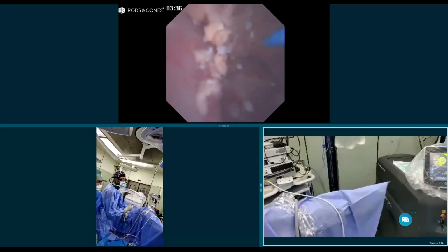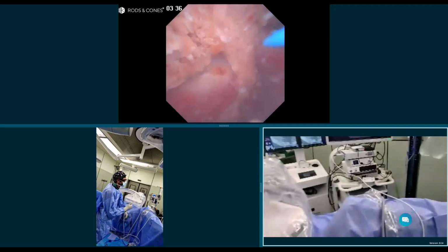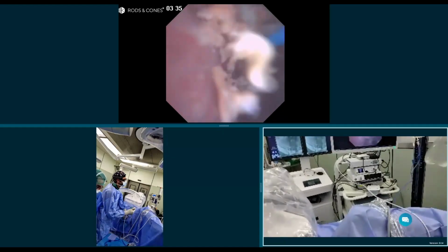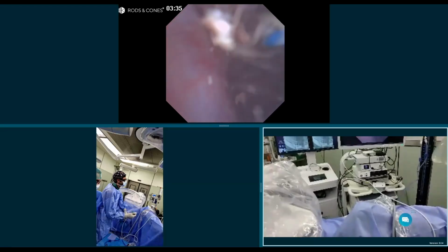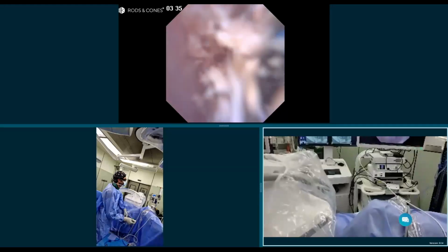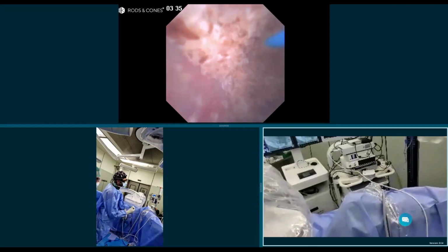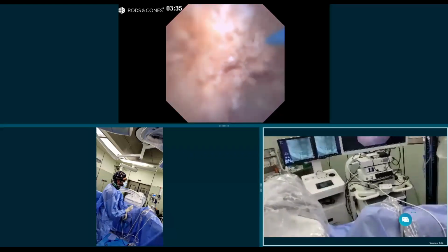¿Me abres un doble J siliconado del 24? Sí, silicona. So I'm going to place a double J stent, 24 centimeters, 6 French. This patient is not too tall. I always like silicone stents to try to decrease symptoms in patients. You can aspirate a little bit of debris.